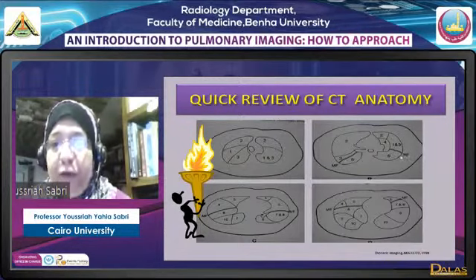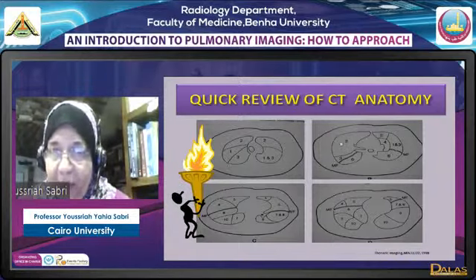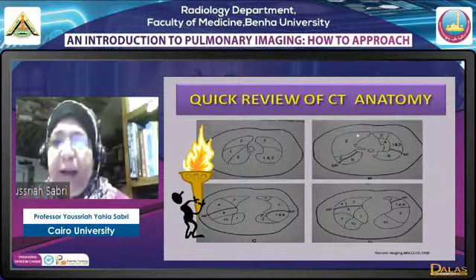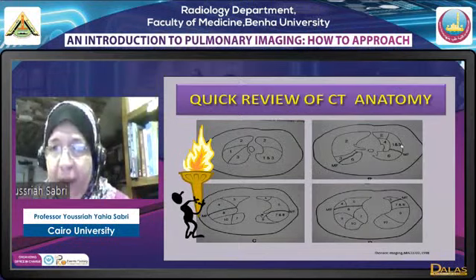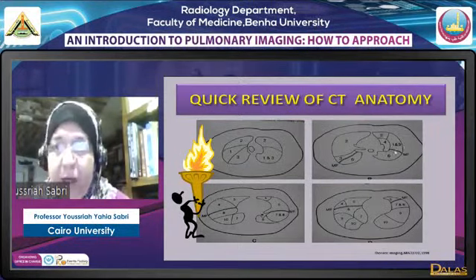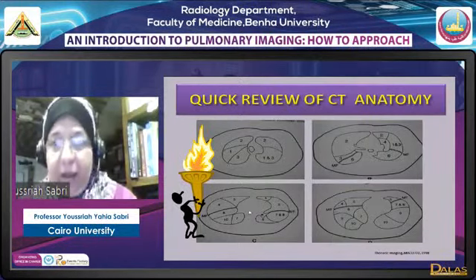Once we have the major fissure, بقى عندنا apical of lower on both sides. Once we have apical of lower, we no more have apical of upper. هيبقى عندنا anterior, posterior, major fissure and apical of lower، وهنا anterior وهو السيجمنت هنا اسمها apico-posterior. تمام. وبعدين apical of lower. خلصنا الايرواي، يبقى خلصنا الابر لوبس.